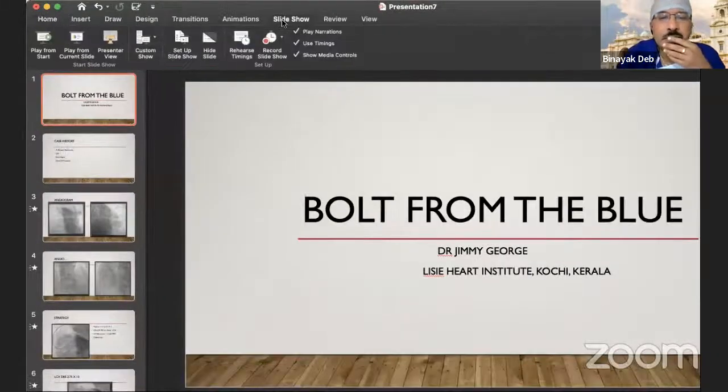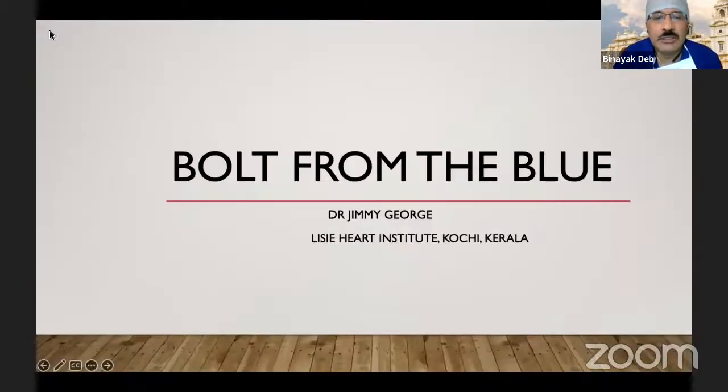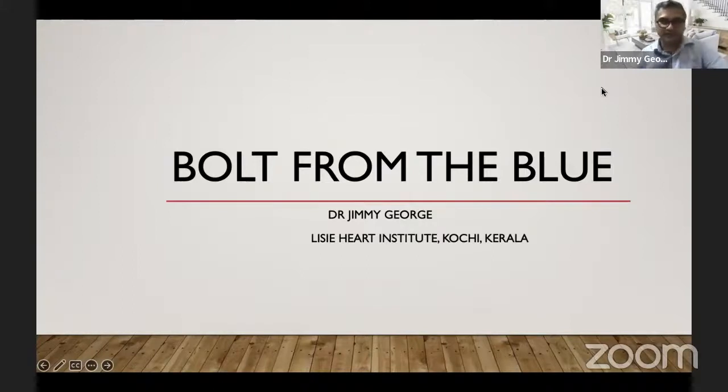on the topic of left main bifurcation, imaging assisted, bolt from the blue. So let's hear exactly what happened. Over to you, Doctor. Thank you, sir. Thank you. I would like to thank Abbott as well as the Calcutta chapter for giving this opportunity. I was thinking it was a complications session, but beautiful bifurcation cases have been shown by both the speakers, and I would be shy presenting not such a great case today.